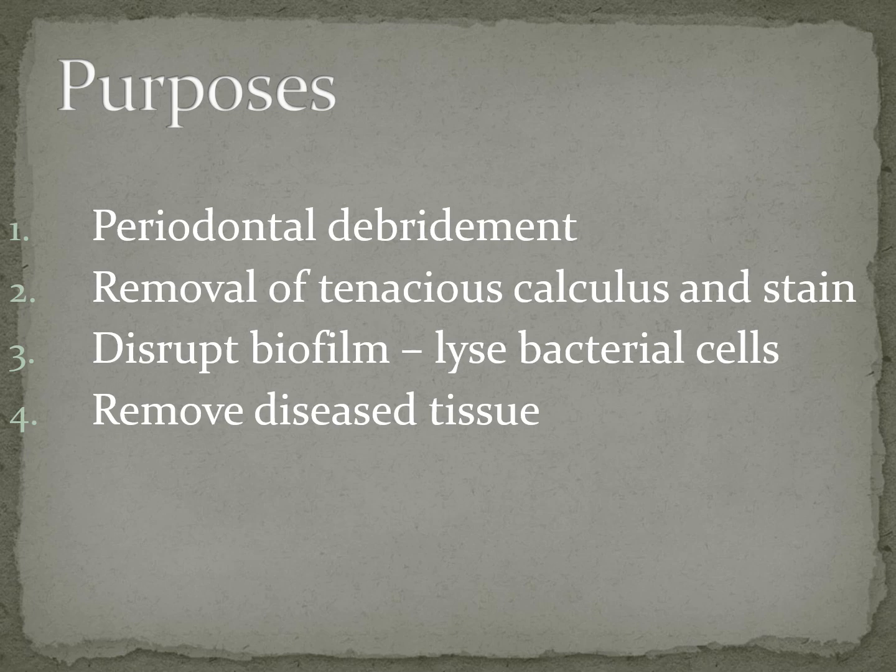Okay, so what is the purpose? A lot of times we will use these ultrasonic or sonic scalers for periodontal debridement. So if you have a patient that has deep pockets, they have a lot of calculus, they have areas that they are not getting clean well. The frequency, the bubbles, the water is going to help us lyse that bacteria and help make that pocket healthier.